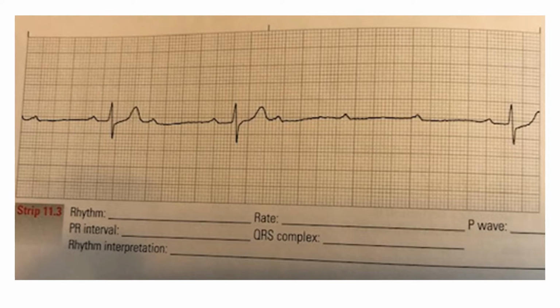If you are not seeing good success, you probably want to put a transcutaneous pacer on. And if that's still not working or if that's not comfortable, you're also going to consider using either an epi drip or a dopamine drip. Epi is 2 to 10 mics per minute and dopamine is 2 to 20 mics per kilogram per minute.